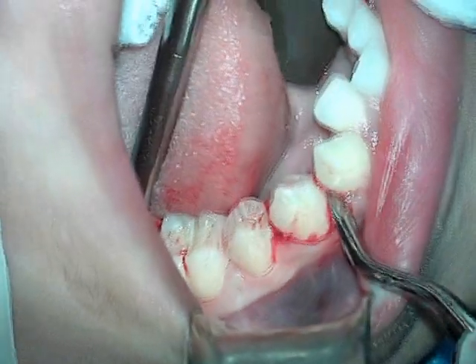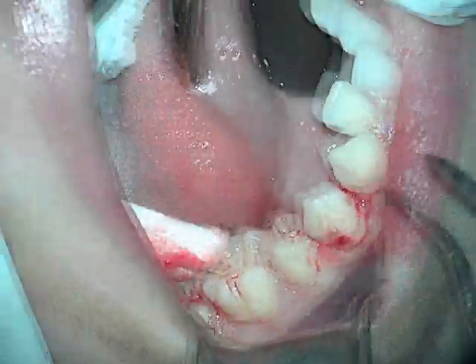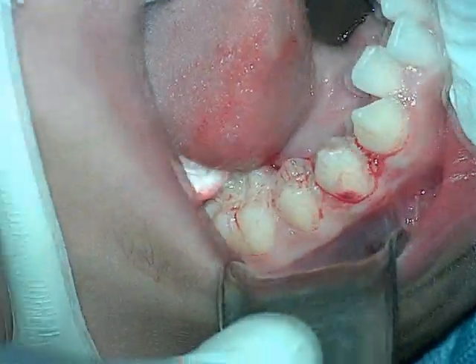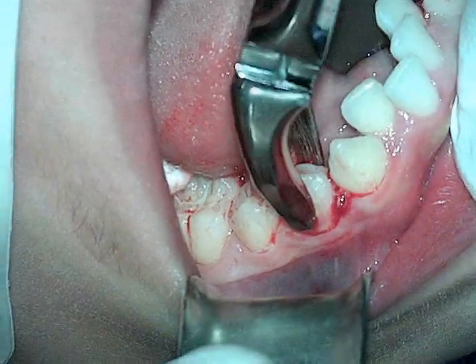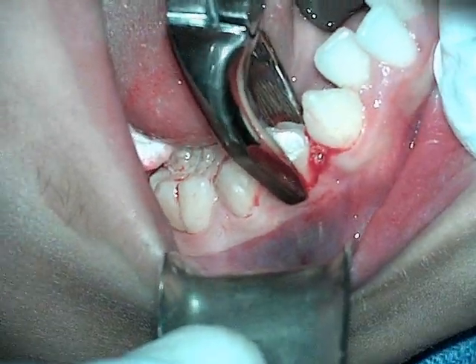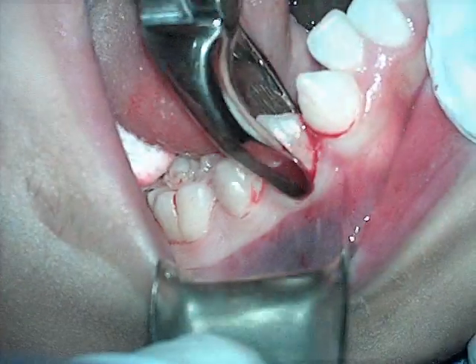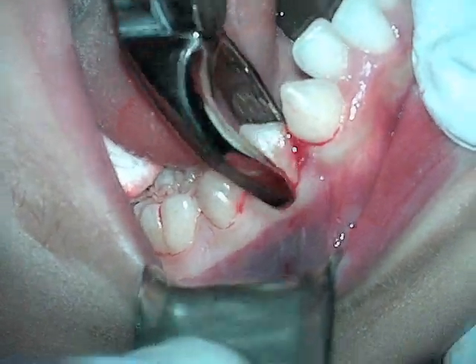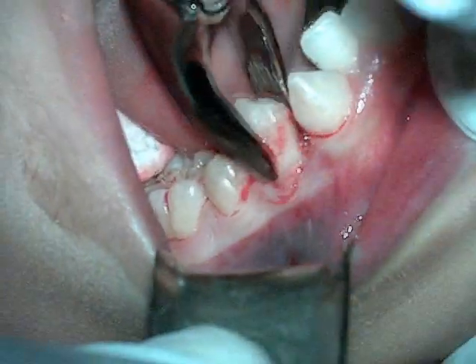the same thing again with a sulcular incision, and then with the 46R elevator on the mesial and on the distal to just get a little bit of movement of the tooth. But the primary work is going to be done with our forcep. So back again with the apical retention forcep, and we're going to place it as far apically down on the tooth as we can. I'm going to luxate the tooth to the buccal and to the lingual and also give some rotational movement in order to expand the alveolus and break the PDL fibers.